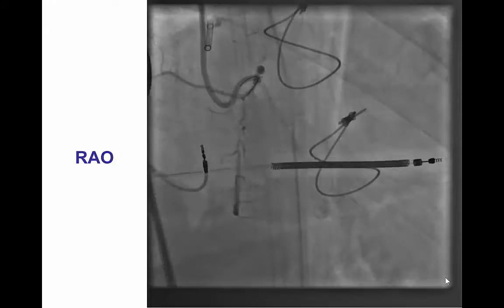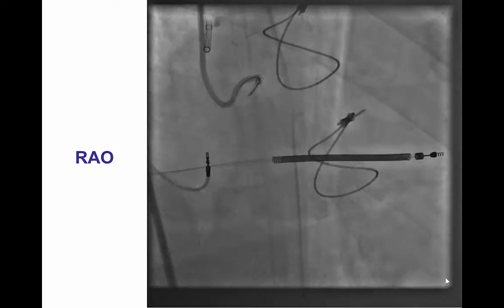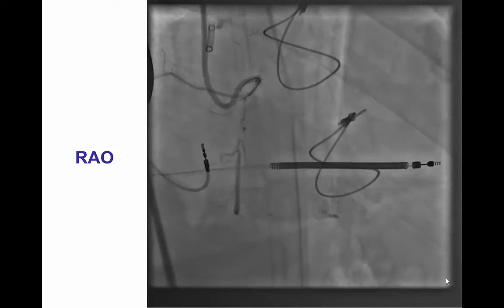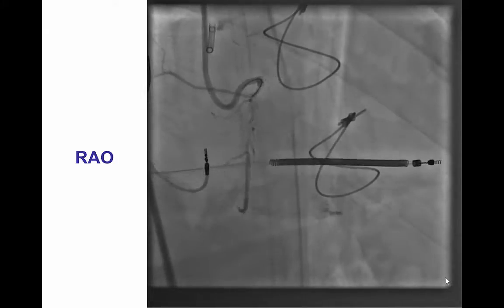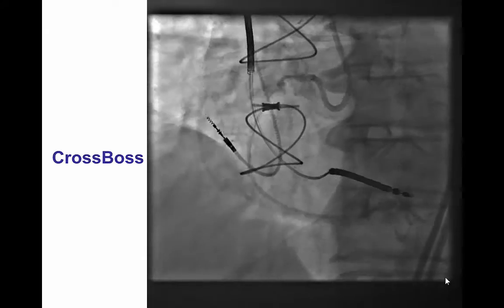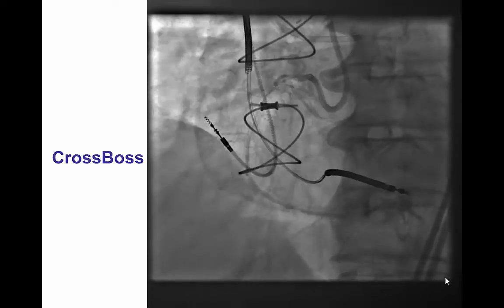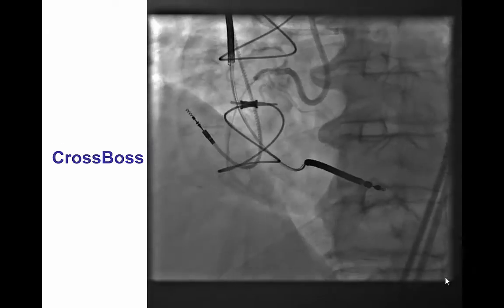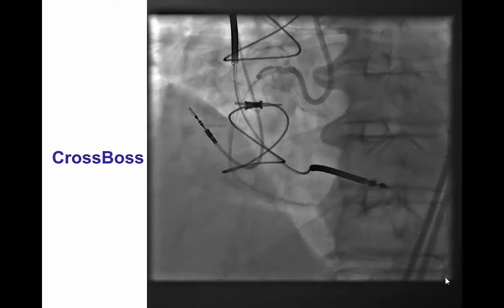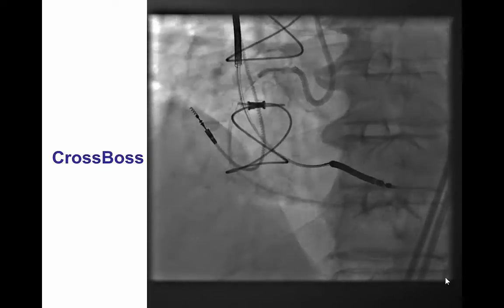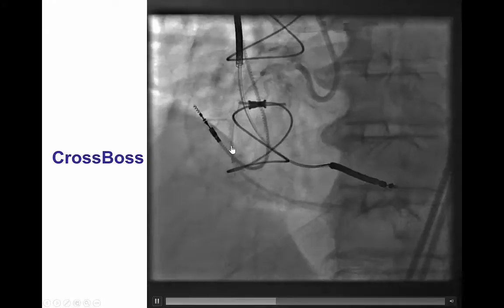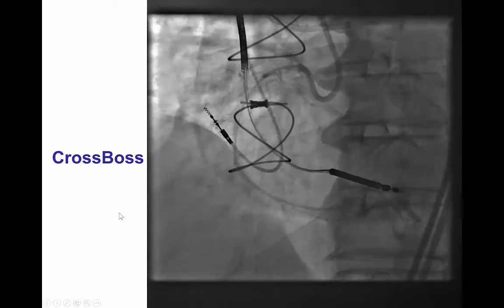We performed multiple projections, and in the RAO view there appeared to be potentially a microchannel coursing through the occlusion. We were able to advance a wire partially into the occlusion, and then advance a CrossBoss catheter, which did cross; however, it went into the subintimal space in the mid-right coronary artery.